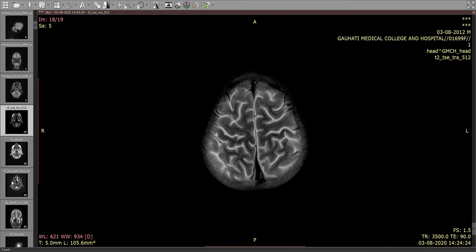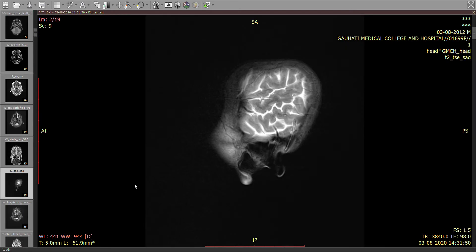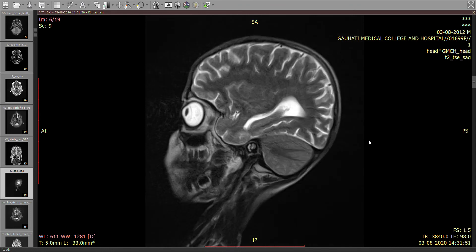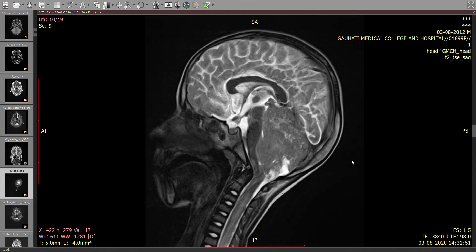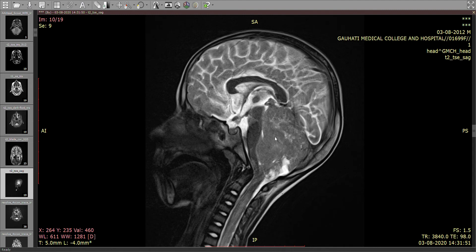Coming to the T2 sagittal images, it is seen very clearly how this mass is centered in the fourth ventricle, causing mass effect on the brainstem anteriorly. It seems to be arising from the vermis and is expanding the fourth ventricle.